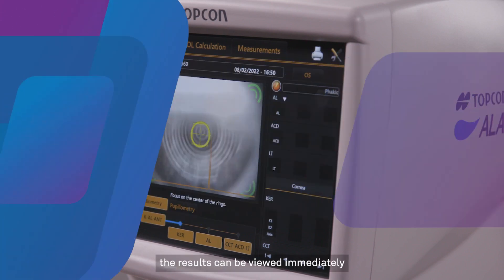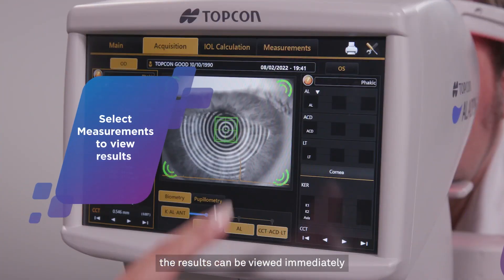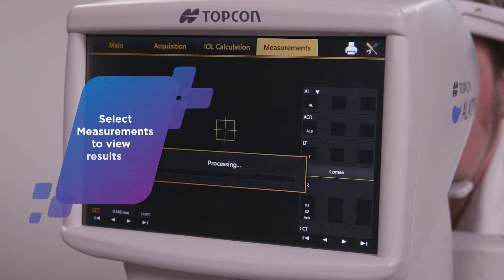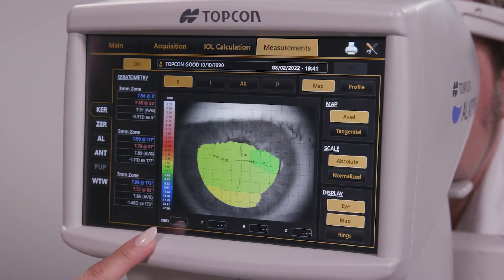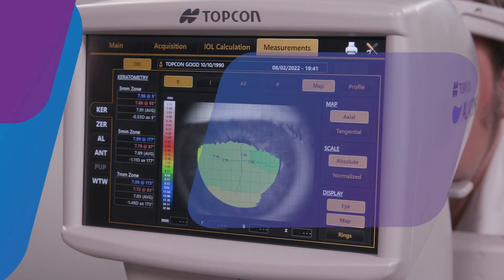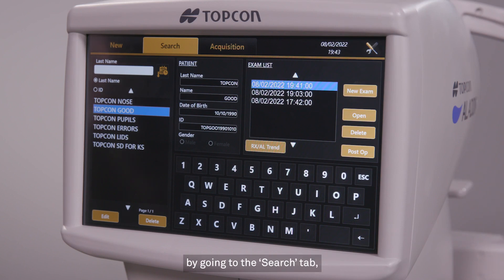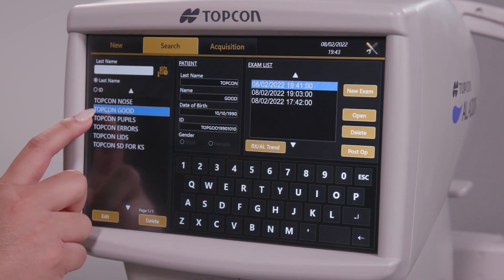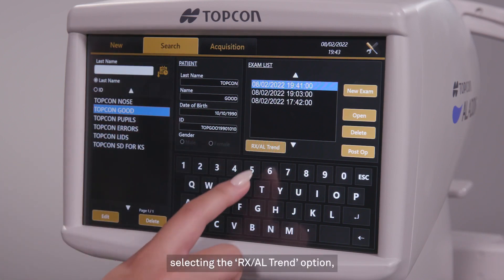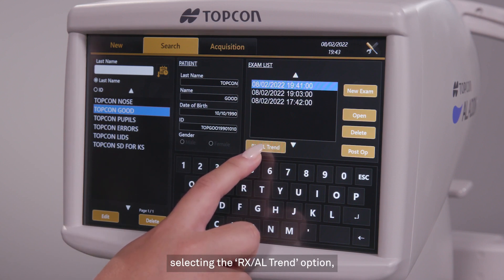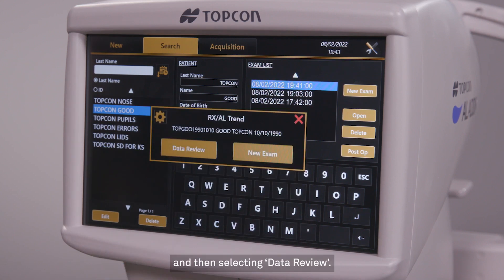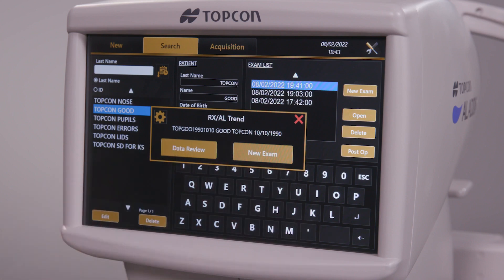After testing, the results can be viewed immediately by tapping on measurements. The results can also be accessed later by going to the search tab, clicking on the patient, selecting the RxAl trend option, and then selecting data review.